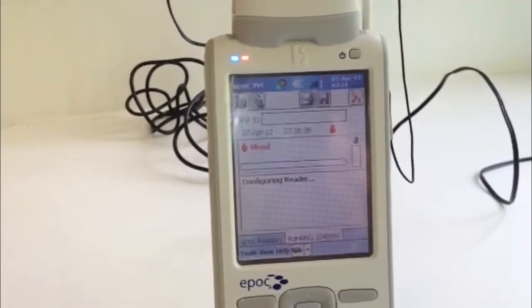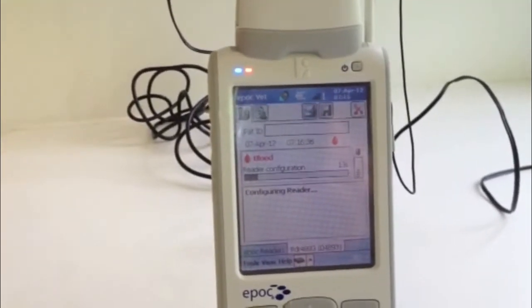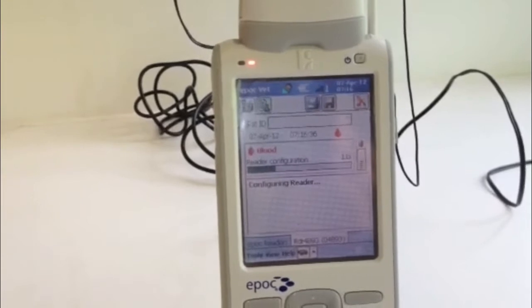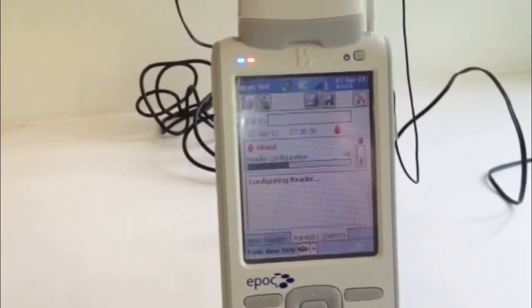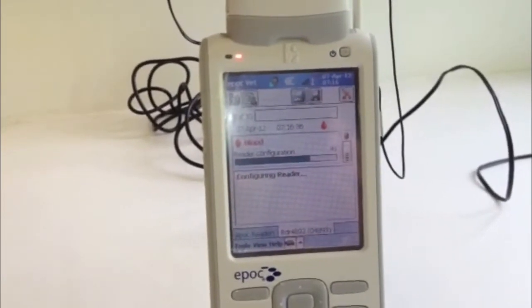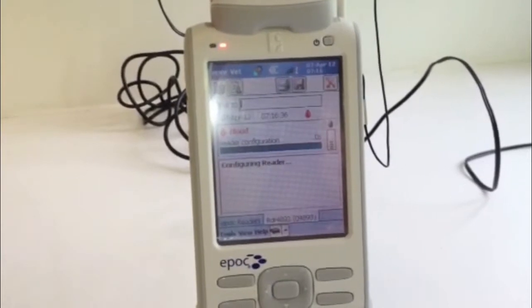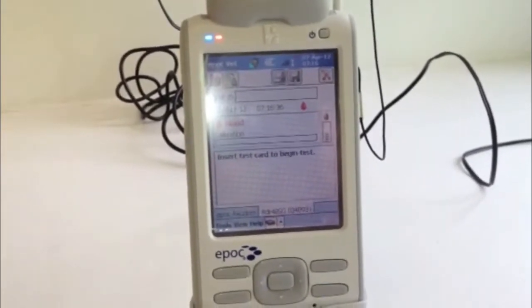The host will then display 'configuring reader' while it runs an electronic QC check. Once this is complete, the analyser is ready for a test and the host will display 'insert test card to begin'.